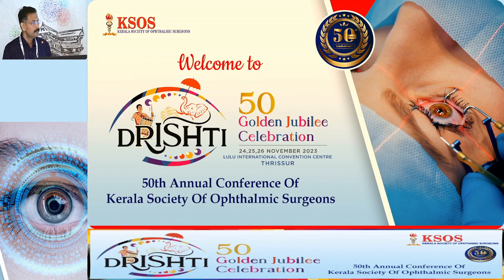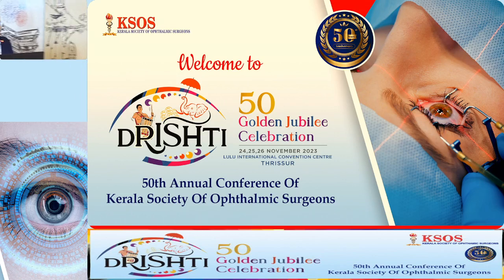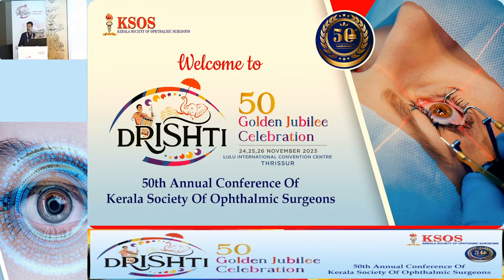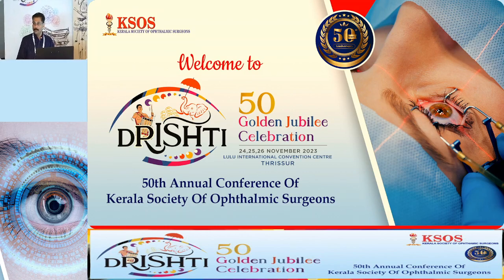Your point that some eyes are more prone to DM stripping, I totally agree with that. But then often we might overlook all that. One question: did you take that video just to show how the wound cornea gets distorted, where you made a slightly anterior entry? Why don't you do your rexis through the side port? This was done by a trainee. So actually, the side port is also a definite option when you have this kind of problem. Go through a side port.